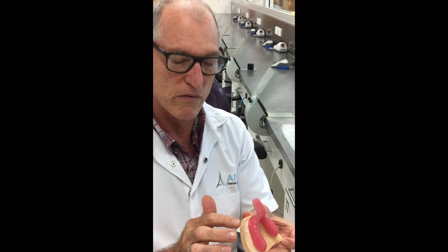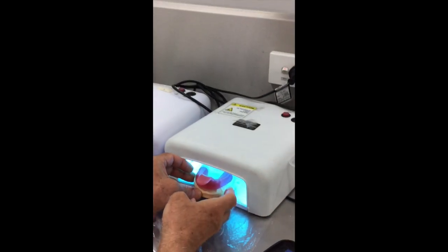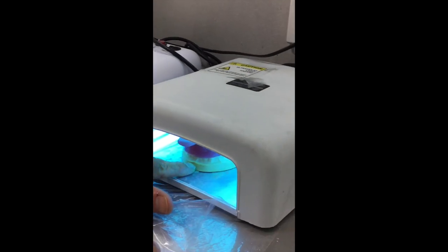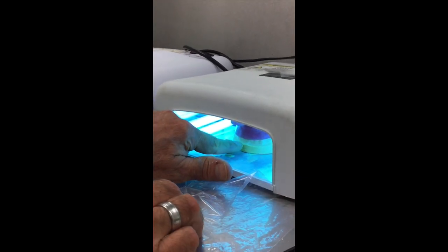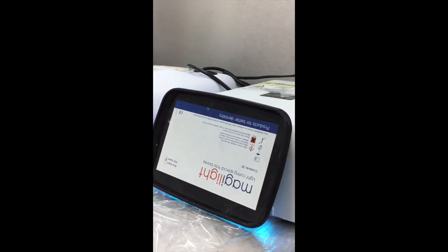So now we've been over our tray and smoothed it effectively with a little bit of Vaseline. I'm going to place it into the light curing unit, and we need to cure that to the specifications of the manufacturer. In this case, we're going to do a minute and a half on that side, and then we will remove the tray with the wax still inside it off the model, and we will cure it from the inside for another minute, and that should cure the tissue stops in the thicker areas of the handle and so on, so that we can then just finish the tray off ready for use in the surgery.